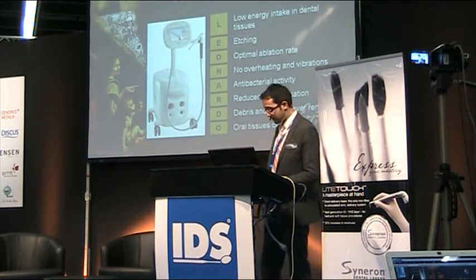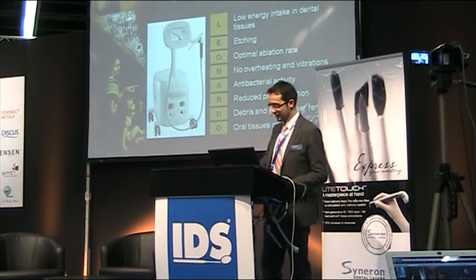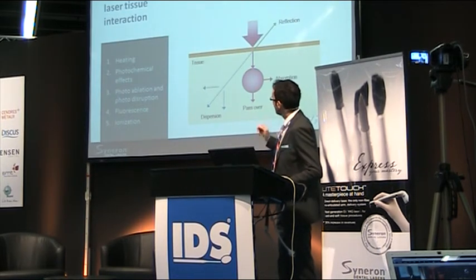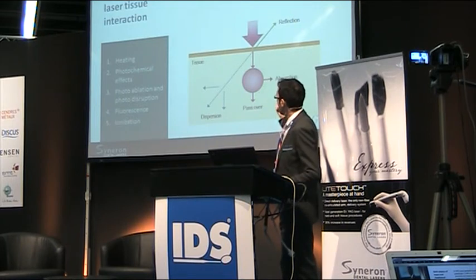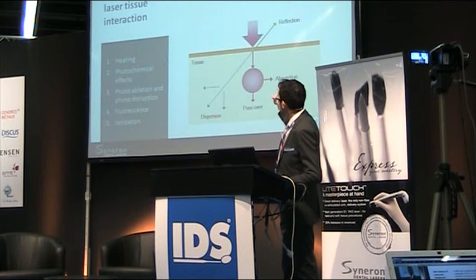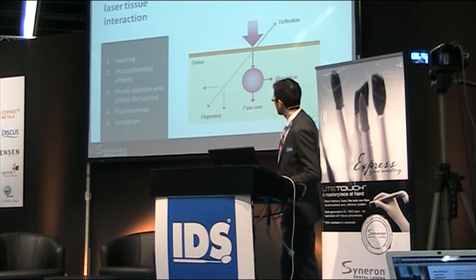So I think that this laser is, according to the Leonardo criteria, absolutely. So, the basic physics of the lasers. This is the interaction with the tissue. Some of the energy is reflected. This is the energy loss, and some of the energy is absorbed and/or passes over.